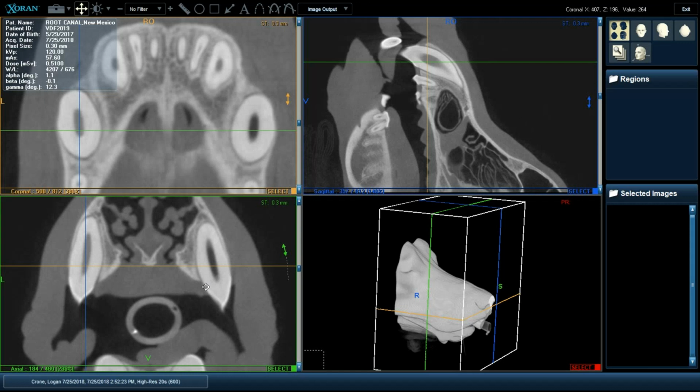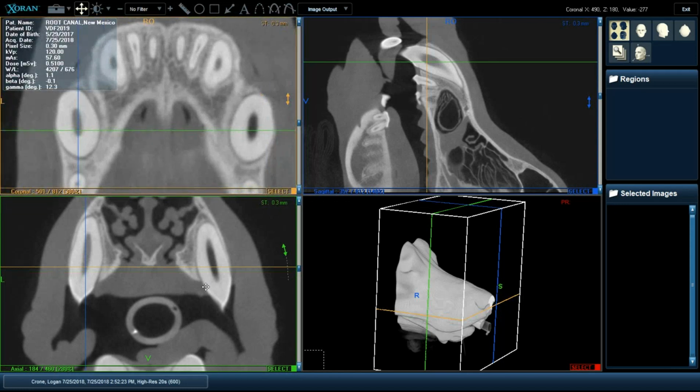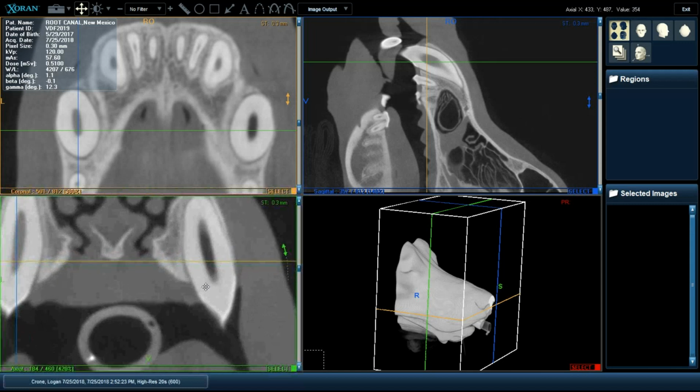As you know, there should be tissue, blood vessels, nerve endings, and such in the endodontic space. And as a result, you'd expect this to not be completely dark, because dark means there is nothing in it. And you can see here this endodontic space compared to its neighbors, for instance, compared to the opposing tooth, is telling us that this particular tooth is necrotic. The tissue has died off within the pulp, and there's no vitality in this root canal.